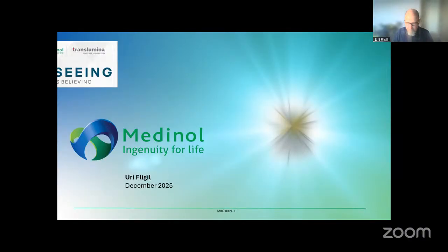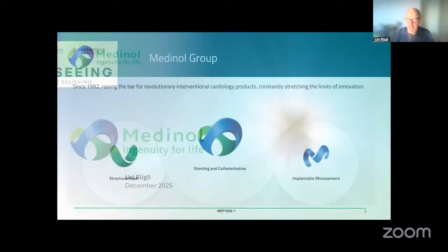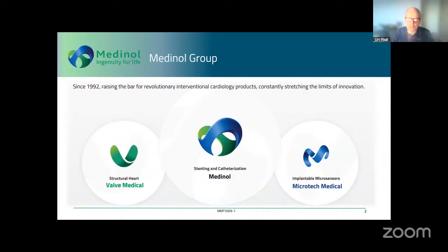So first, thank you very much, everybody, for having me today. It's a pleasure to join you. I want to start with a linear presentation. First, I will start by presenting a little bit of the Medinol group. The Medinol group has been in the market since 1992.